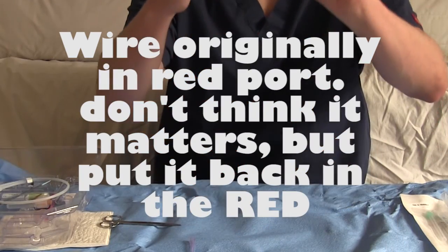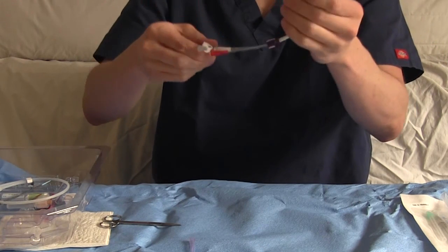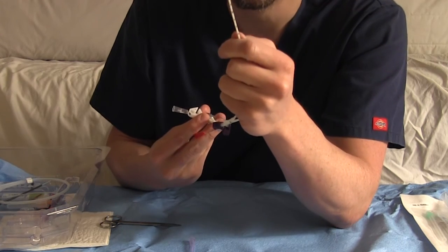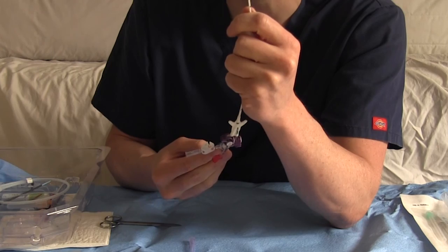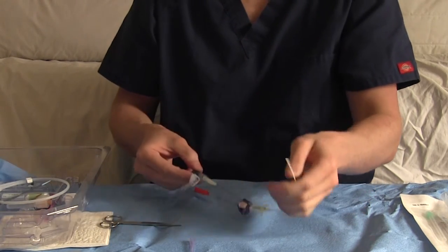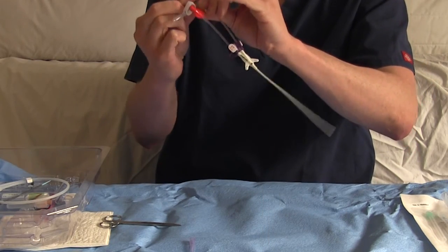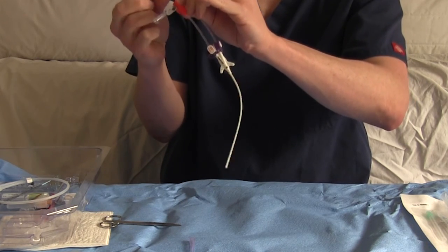And then this little side adapter thingy just luer locks around this port. Push the wire in all the way to the hub, and it'll actually pop out the tip. Now you want to pull it back so that it's at least a quarter inch back from the tip of the midline. You do not want it protruding. And then this little blue dial here locks it in so that it can't move back and forth and it can't protrude out of the vessel.